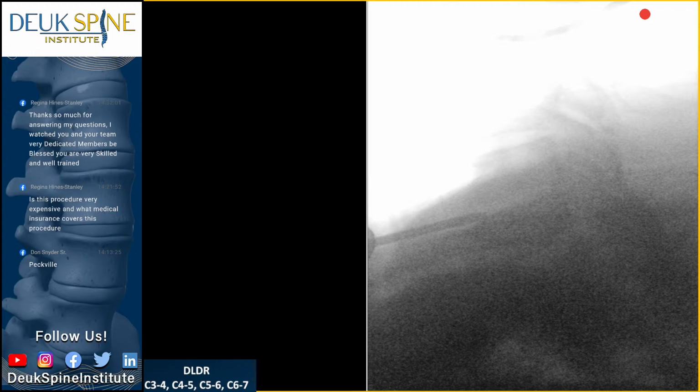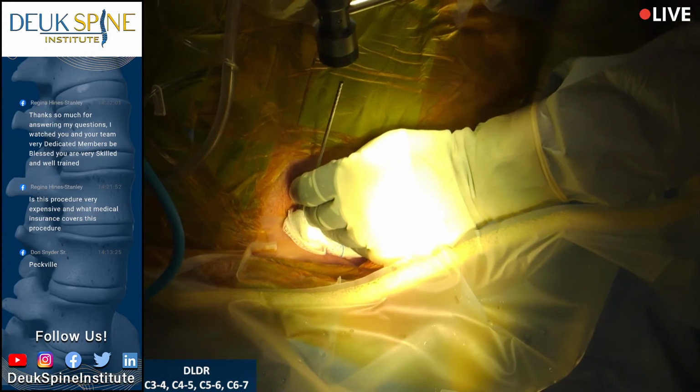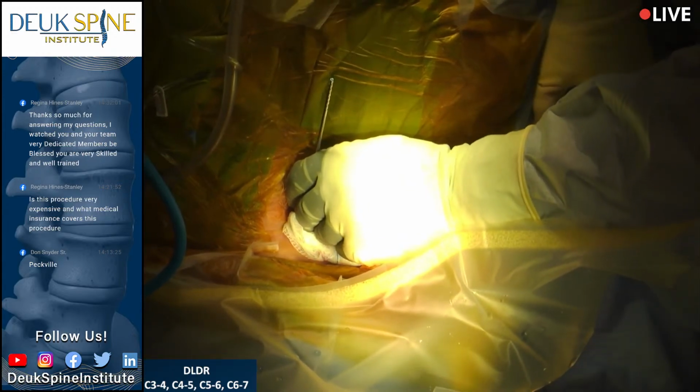That might be it. Give me an AP. Let's see where we are. If we're in the midline, then we're good. Yeah, we're good enough. Just off to the side. All right, good. Lateral. This should be it. And give it to me. I can't believe it. We got it.